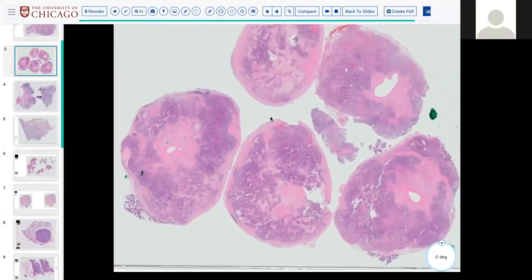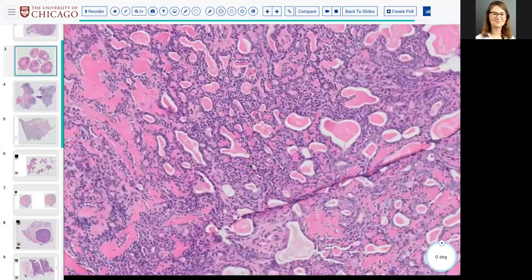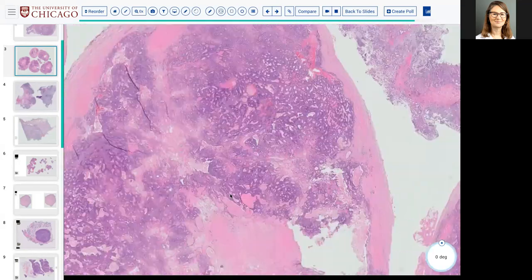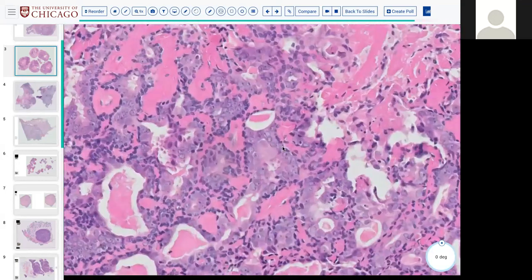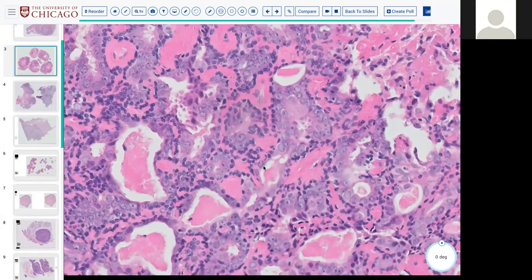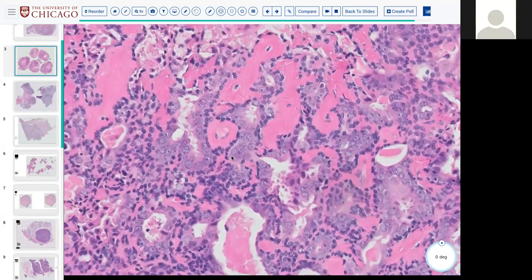The epithelial. Okay, all right. So I'm going to go back to that epithelial area that I think we saw that looked like it's either invasive or at least in situ. This is the impression that I got. So maybe we need stains to highlight the myoepithelial component. I prefer to do P40 or SMA or any myoepithelial marker.